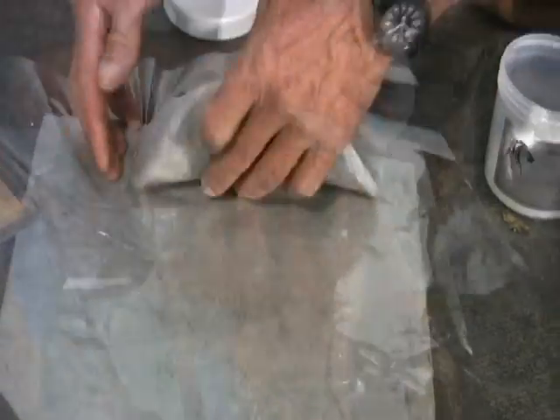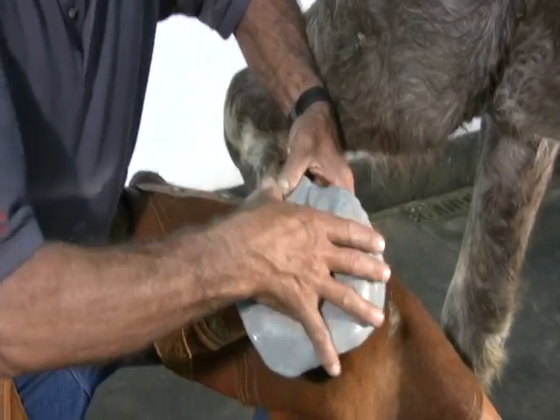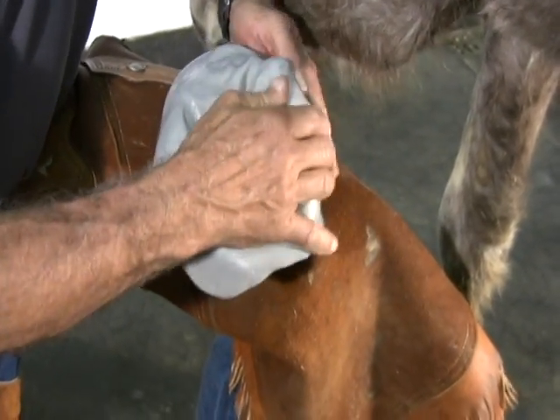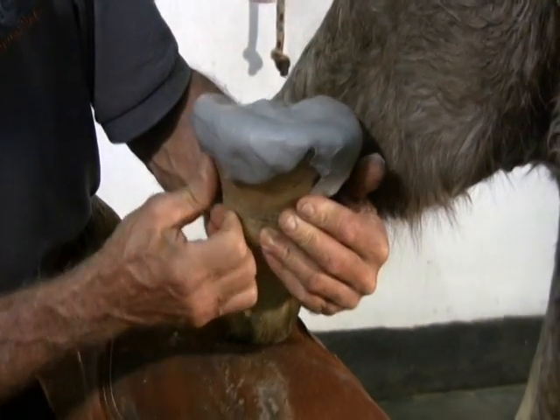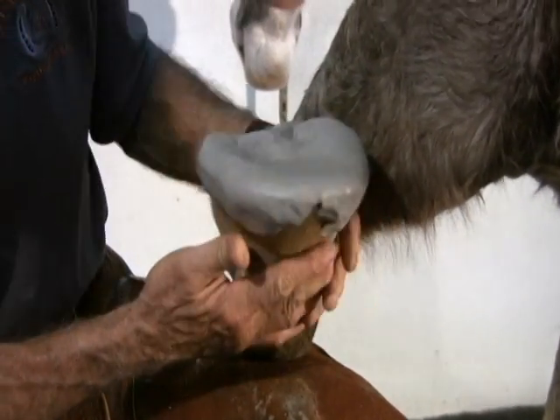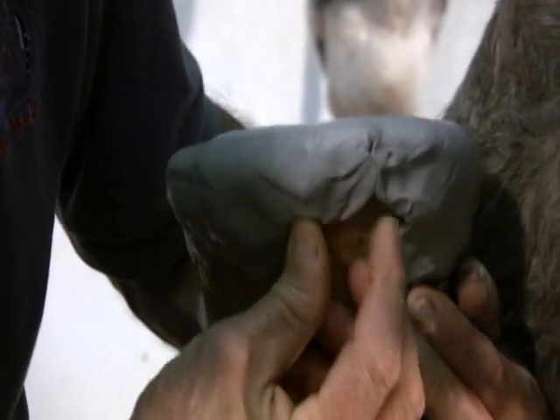Now remove the ACS and lay the material on the foot, firmly pushing the material into all crevices, making sure there is contact with the entire surface of the foot. Fold excess material over the edge, being careful not to let it get too thin on the edge of the hoof. Using your thumb, press the border of the material blending it into the wall.